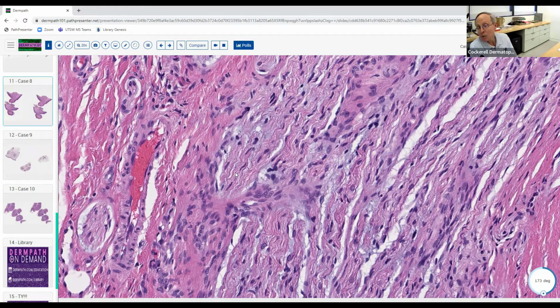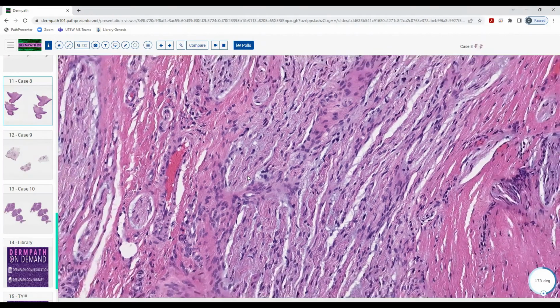There's a bunch, but there are three main mesenchymal spindle cells that we see in dermatology primarily. We just saw one in the previous myxoma. Those cells in there were fibroblasts, right? Fibroblasts, yeah. Okay. So what's another spindle cell? Smooth muscle cells. Good. And then what's the third one? Nerve. Nerve. Good. Now there are others, of course.